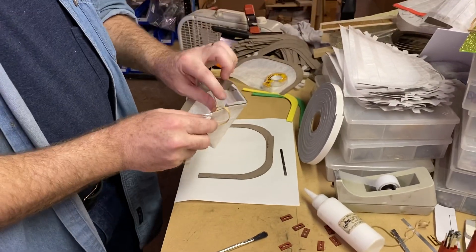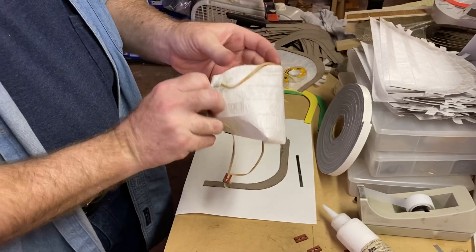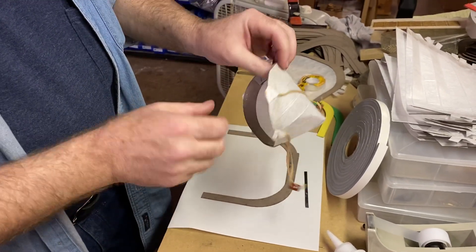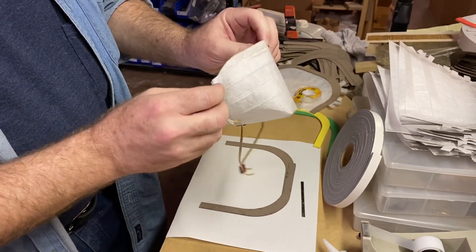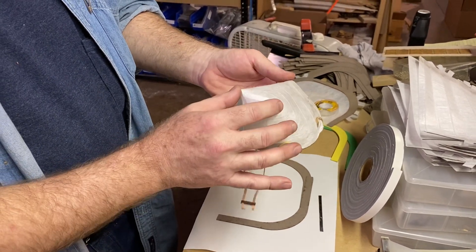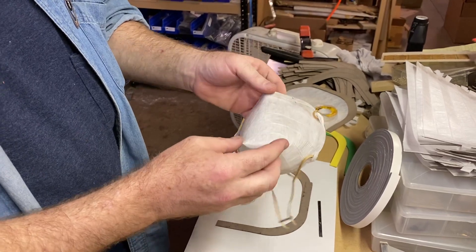Hi folks, Howard with Raglan Piano Company. I want to show you guys just briefly a mask that we've started producing. This is not really a substitute for an N95, it's just going to be as close as we can get for the perilous times that we're in right now. The filter material here is made from a Filtrete 1900 filter, which is good for catching viruses and bacteria.